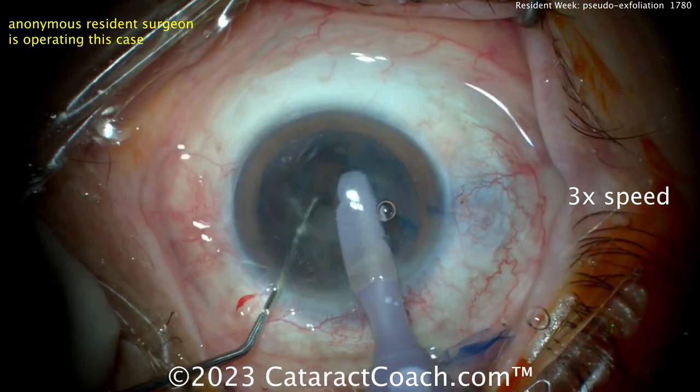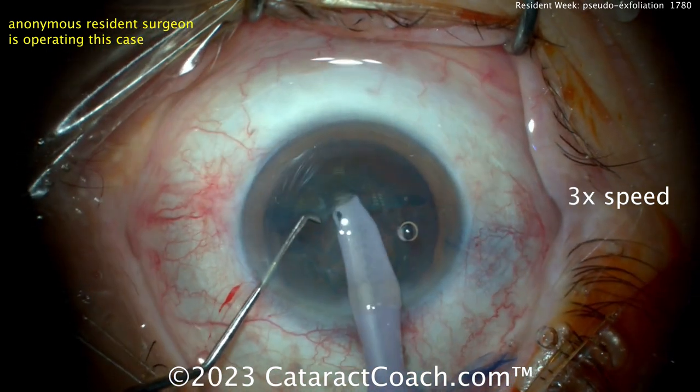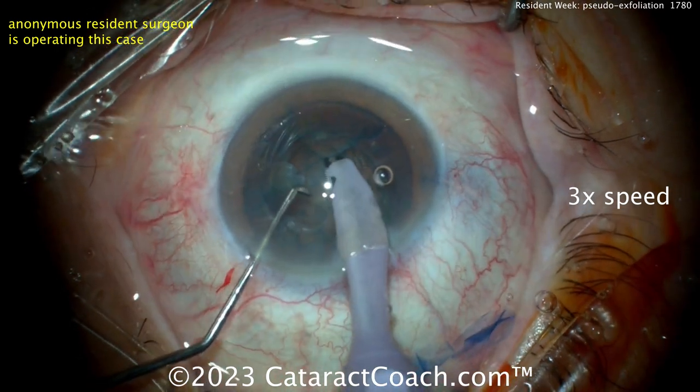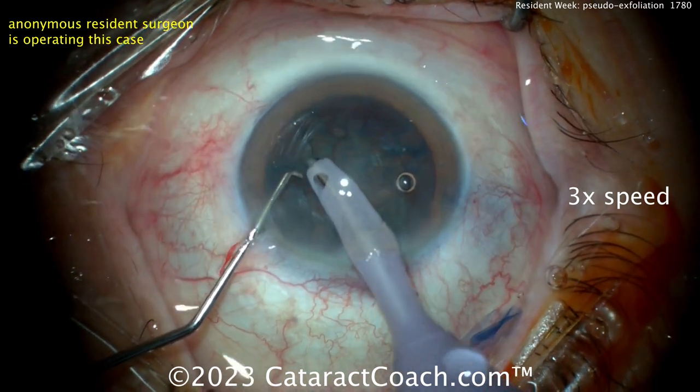A little more grooving — because you didn't get it fully through the first time. But there we go, now you're looking much more separated. Go careful. You can see it's not that dense of a nucleus, and if you go through the periphery of the nucleus with the phaco probe, you can pop that capsule.